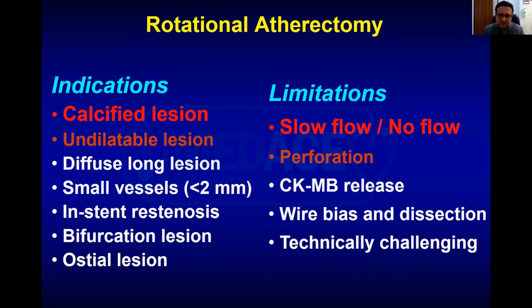In-stent restenosis. I know it's a bit of a debate where some people don't like using it, but I have very good experience with it, and I haven't found any issues with using it in stents. Bifurcation lesion and then ostial lesion.